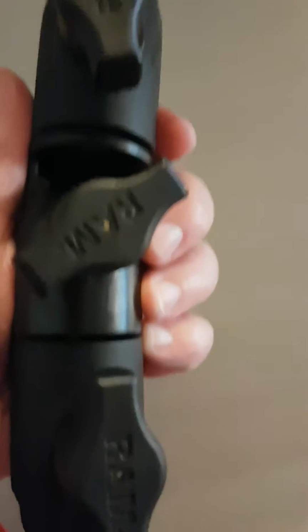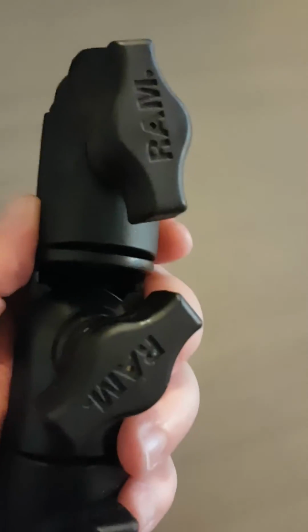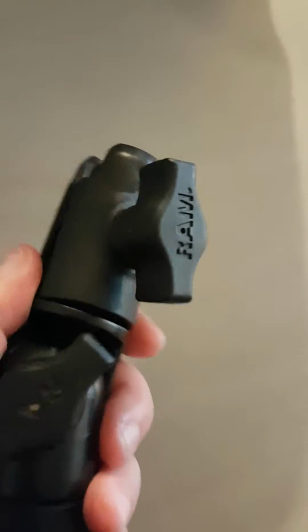Okay, now this swivel arm, I had to modify it. First, let me show you something neat about the swivel arm. Once the socket is loosened completely, these arms can twist, so you can put these at basically whatever angle you want. And then this is the swivel. So it swivels like that. Let's pick this guy up. There you go.